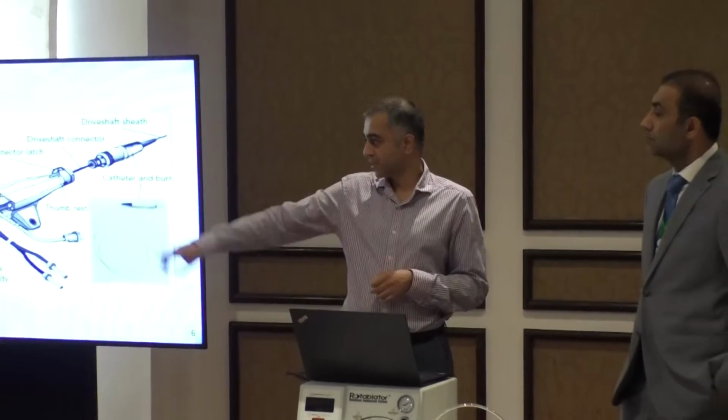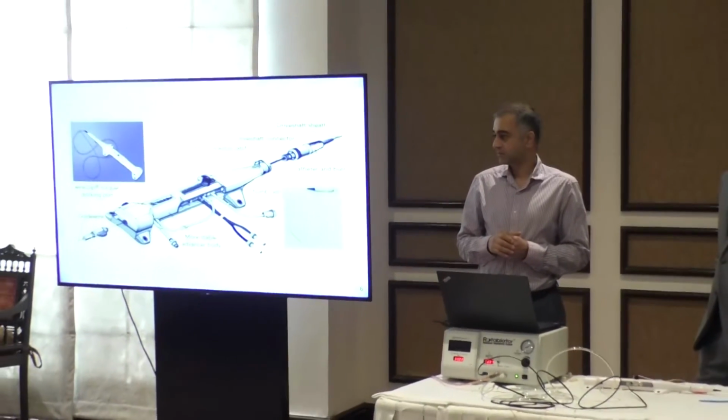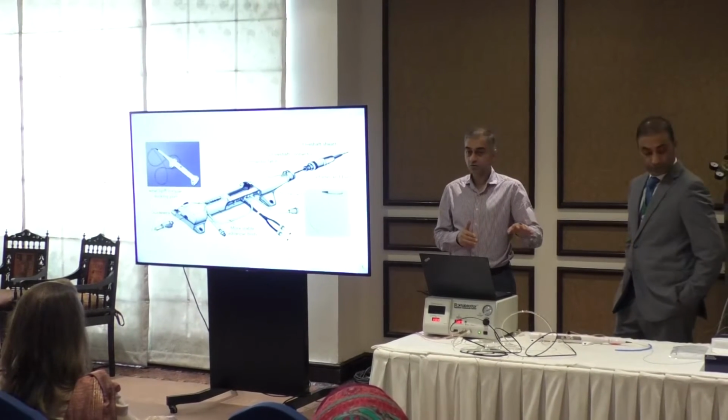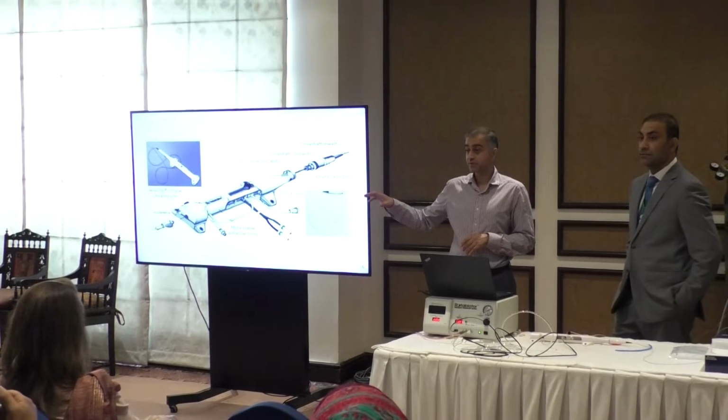So this, I guess, is the old console. There is a new console that's available as well now, known as the Rotor Pro, which is demonstrated over there. And what is going to happen gradually, I suspect, is that they're going to do away with this old console, and Boston Scientific are going to move to the new Rotor Pro at some stage.